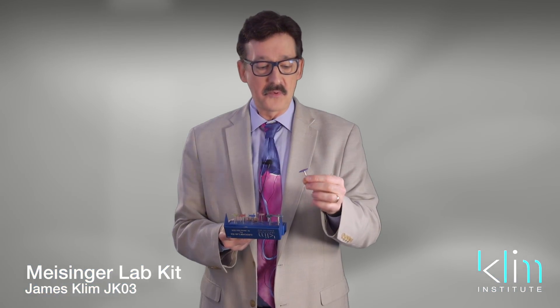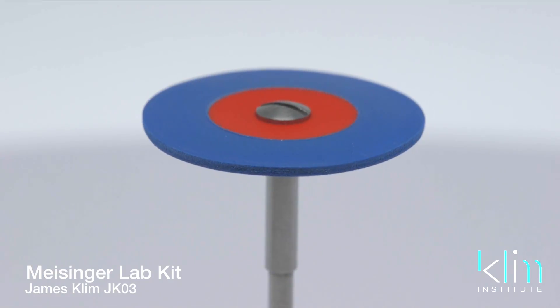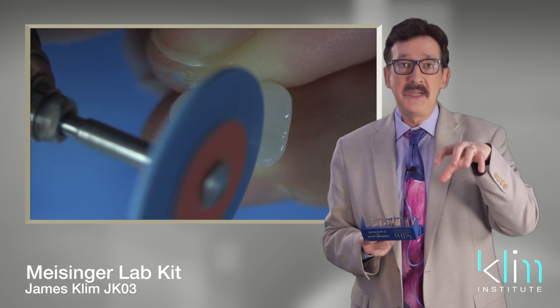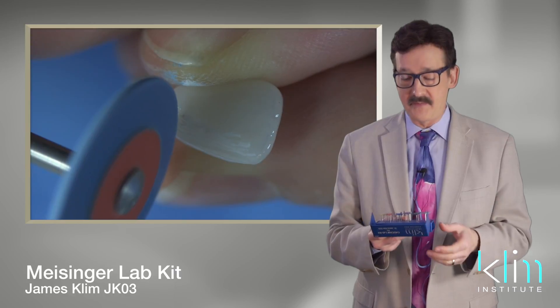Then we have the medium polisher wheel. This is for after glaze. If the ceramics are polished too much before the glaze, the glaze can beat up on that ceramic like water on a wax car — so we have to be aware of that.